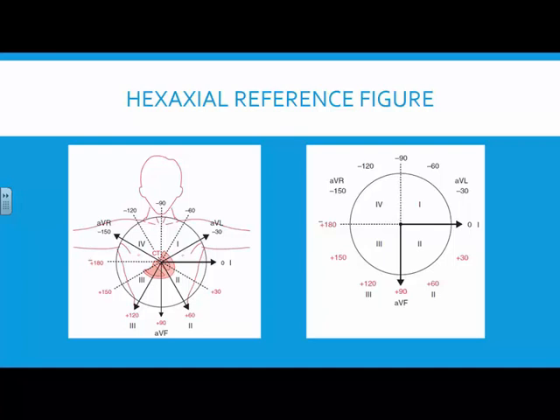Okay? Got it? All right? And then it just kind of comes back again to the point to where now we're picking up repolarization. All right, and there's still a little bit of electrical current flowing with repolarization. Remember, it's the movement of the ions and all that. And so it's still going to be positive towards that. All right, does that make sense? Make a little bit better sense? Yes.